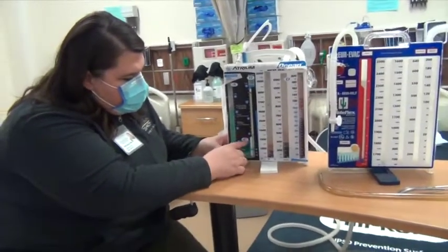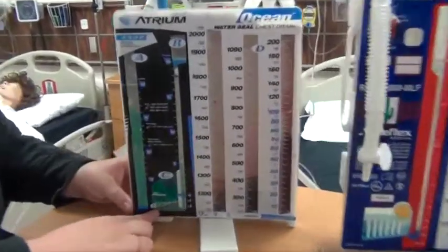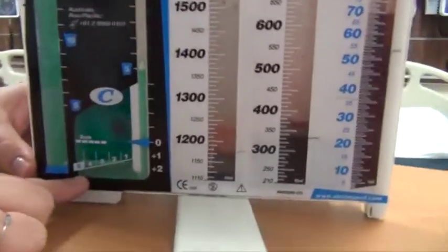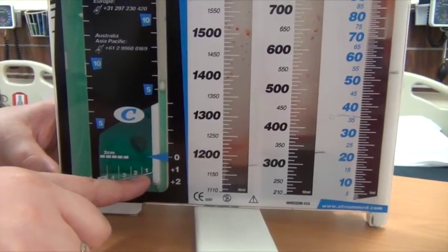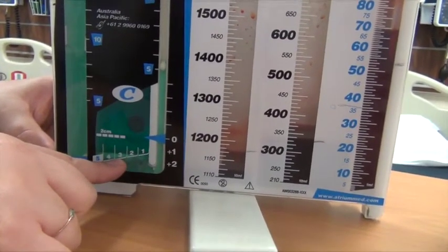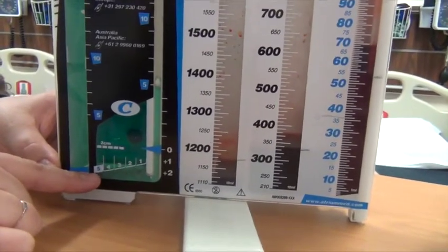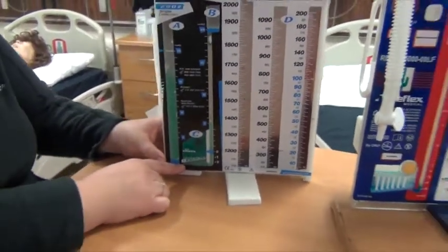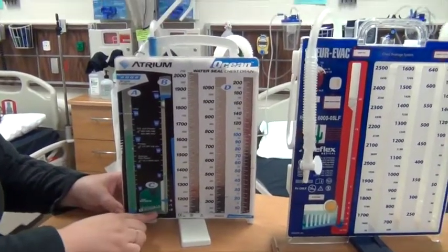And then also this is where you would see an air leak. You'll see on the air leak monitor, it's calibrated 1 through 5. So if you had bubbling that went to here, it would be a +1 or a +2 or a +3. And the big thing with the air leak is you're just making sure that it didn't get any bigger. It's very common for someone to come out after surgery, or right after this is placed, to have an air leak.